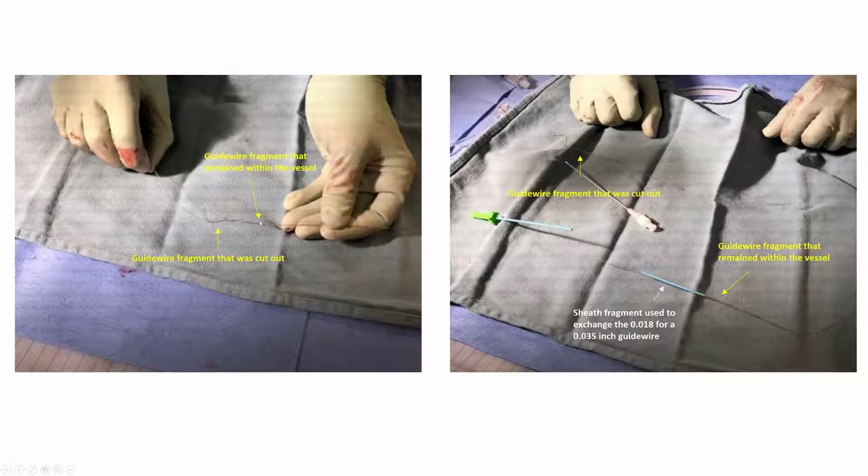And this is what came out. This is the kinked wire fragment, and this is an illustration of getting the sheath and then cutting the distal portion of the sheath and using that over the remaining part of the micropuncture wire to get into the vessel and then exchange for a 0.035 inch guide wire.